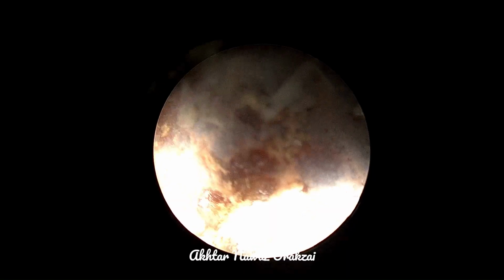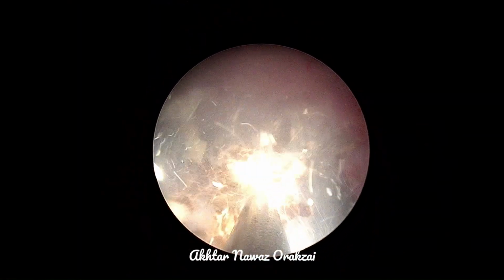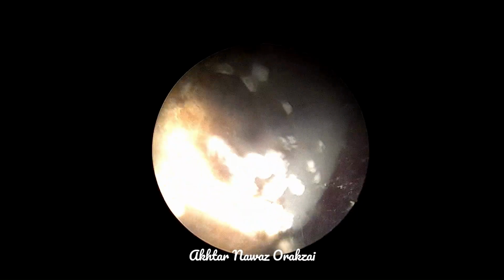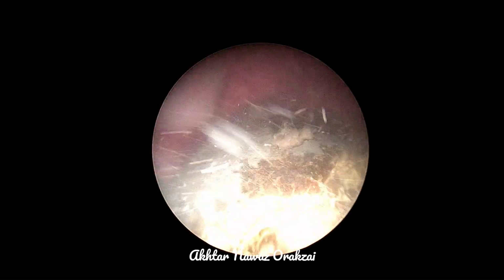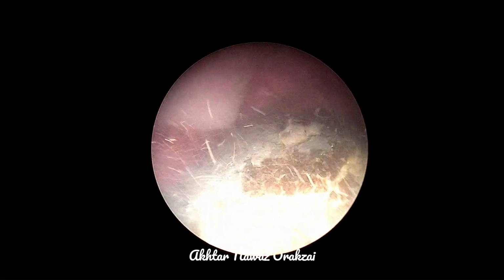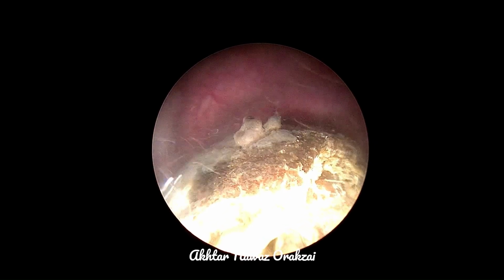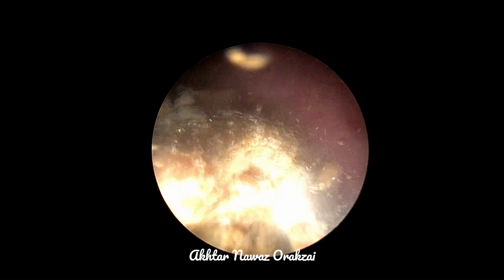So the indication of percutaneous cystolithotomy or lithotripsy or lithoclasty in this case was that the patient was having an above knee amputation of the right leg, and he also had a spinal fixation due to a road traffic accident years ago.